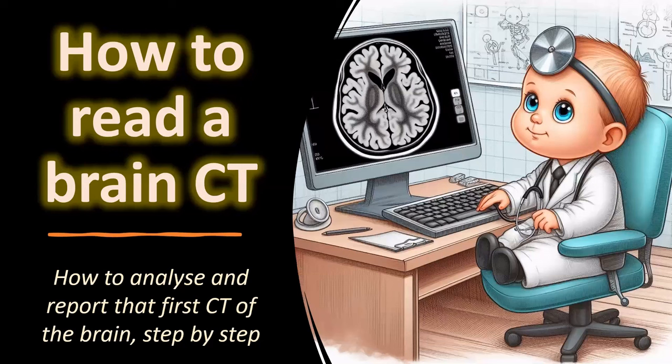I am a neuroradiologist in Ghent University Hospital in Belgium, and welcome to this presentation on how to read a brain CT. This presentation will cover the basics of analyzing and interpreting a CT of the brain and is mainly aimed at medical students and young radiologists at the start of their career.